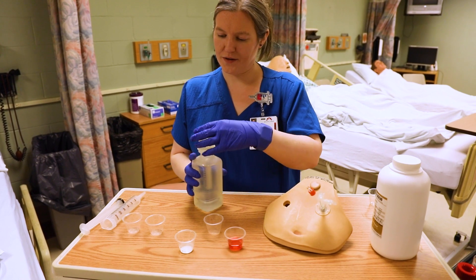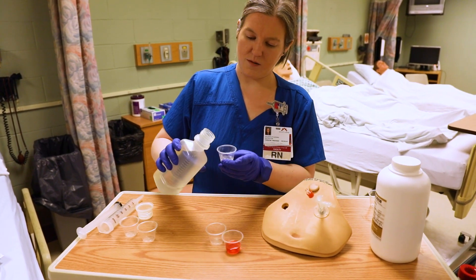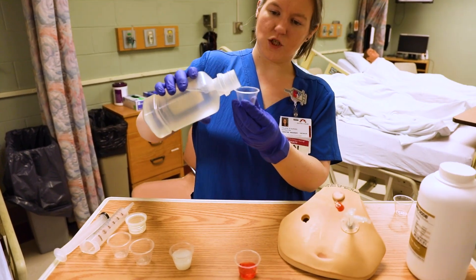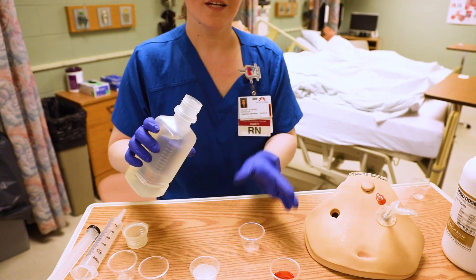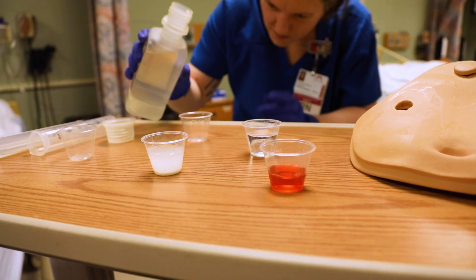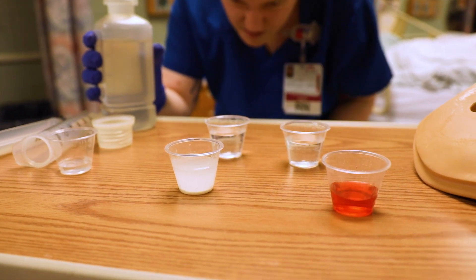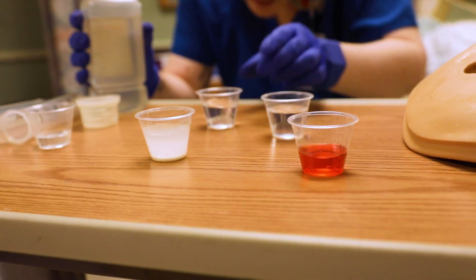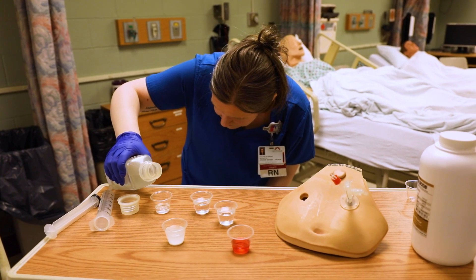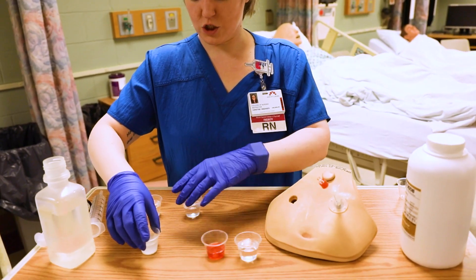I'm going to open the sterile water. Make sure your sterile water is labeled with the date and time if it's already been opened. Between each medication we have to flush — also double-check that your doctor doesn't have a fluid restriction on your patient. I'm going to do about 20 ml's between pills to help monitor intake and output. I'll get it organized: water, medication, water, medication, water.